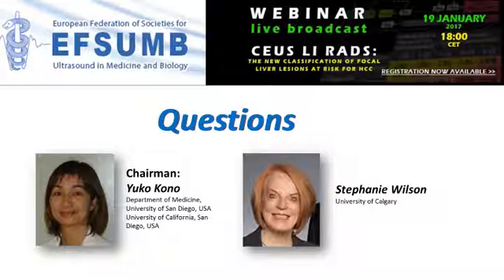When it comes to questions about contrast agents, we have to recognize that we don't all use the same contrast. In Canada, I have used Definity from Lantheus Medical Imaging since our introduction of CEUS in Canada, now a long time ago.